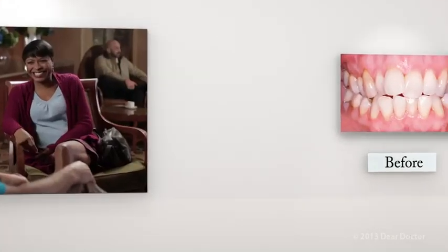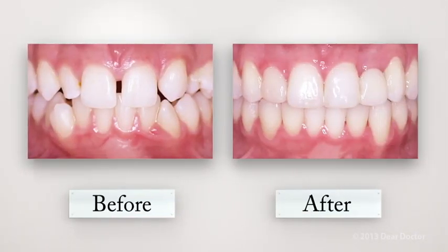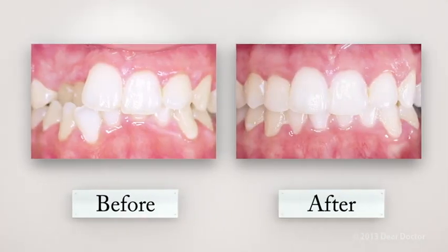Clear aligners can correct crowded or crooked teeth, a very common problem, gaps and spaces between teeth, open bites where the upper and lower teeth do not come together, and cross bites, to name a few orthodontic problems.